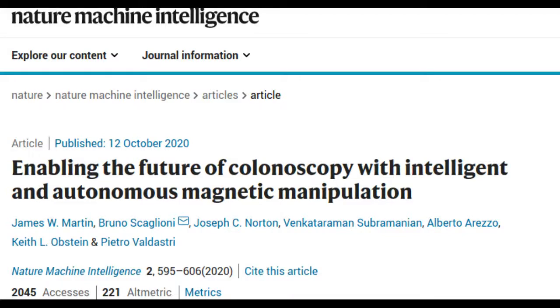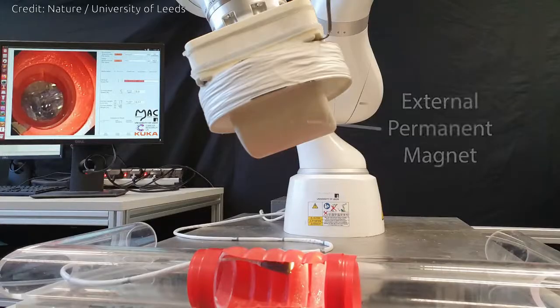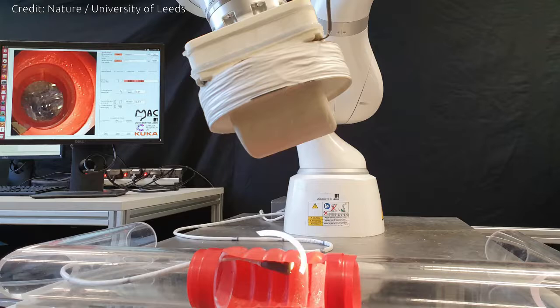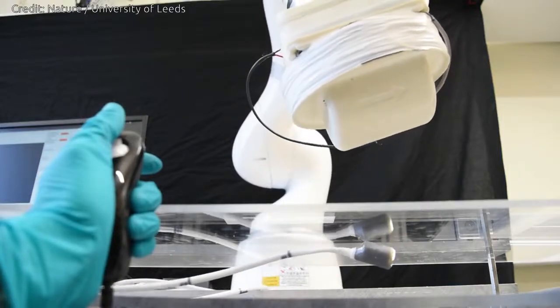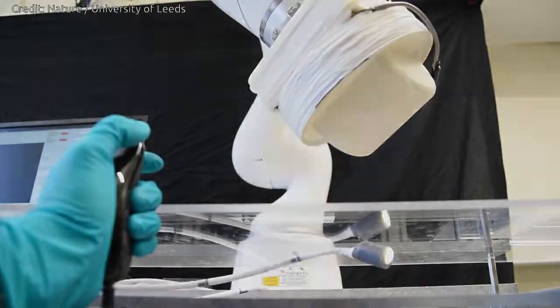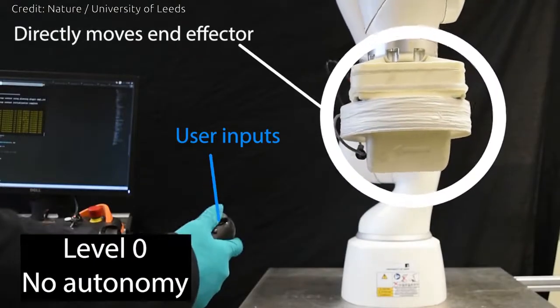Scientists have made a breakthrough in their work to develop semi-autonomous colonoscopy using a robot to guide a medical device into the body. The milestone brings closer the prospect of an intelligent robotic system being able to guide instruments to precise locations in the body to take biopsies or allow internal tissues to be examined. A doctor or nurse would still be on hand to make clinical decisions, but the demanding task of manipulating the device is offloaded to a robotic system.